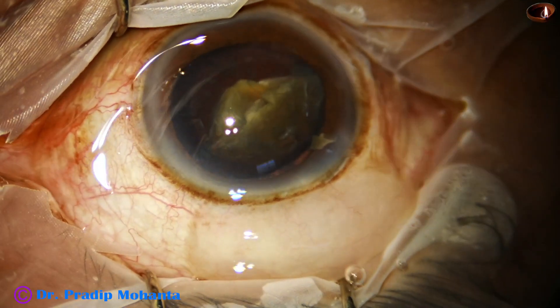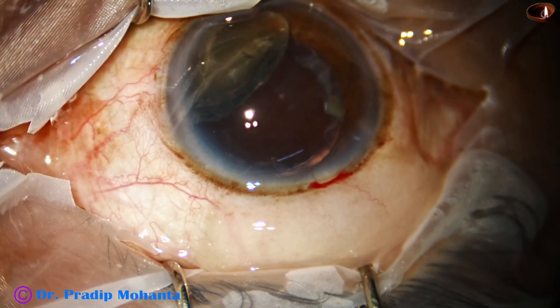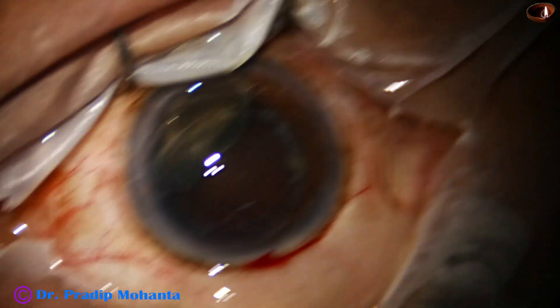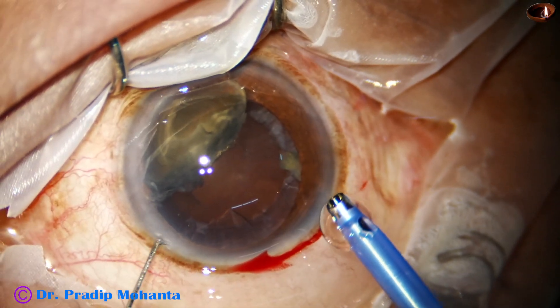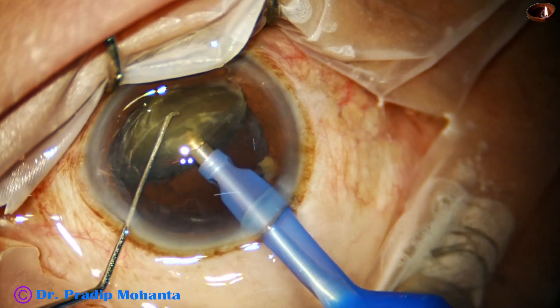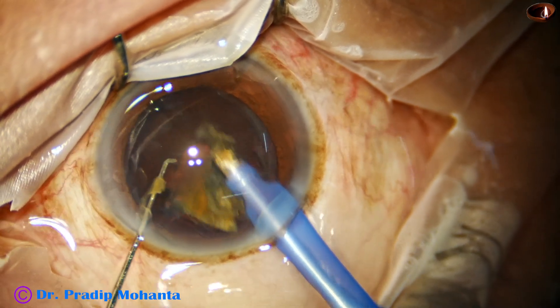Now I come out. My plan is to inject Visco and push the posterior capsule far behind. Now I go again with the handpiece. The phaco needle goes in — in this case it goes bevel up, because the wound is enlarged, so it can easily go with bevel up. And now the last portion of the nuclear piece is emulsified.